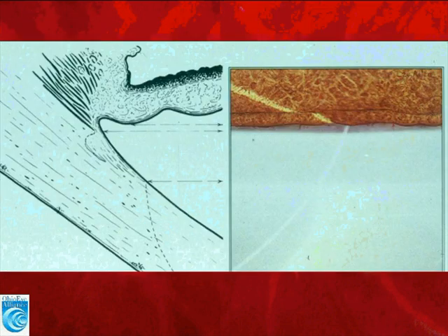In this image, where there is almost no pigmentation of the trabecular meshwork, it is extremely difficult to find landmarks for lasering unless we use the corneal wedge. In this case, the wedge is rather faint, but we can see it coming in from the bottom left of the image on the right, and where the wedge comes together is a line, and that is Schwalbe's line. Unfortunately, while we're looking at patients, we don't have histologic drawings next to us, but we have to think about things histologically and try to understand where we're looking at a structure when we're looking at it en face.